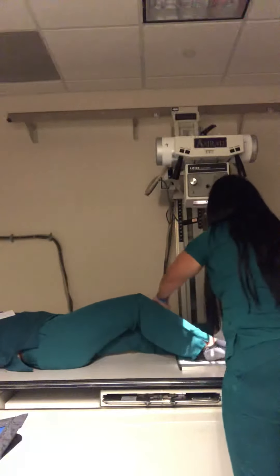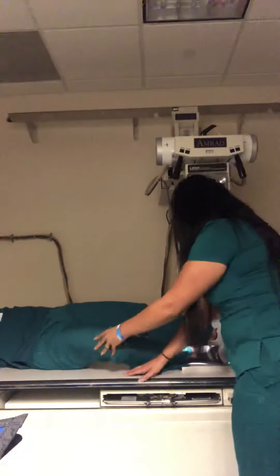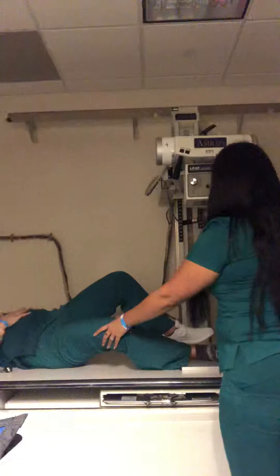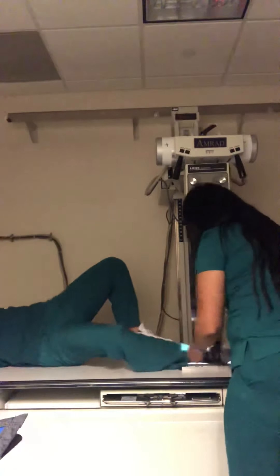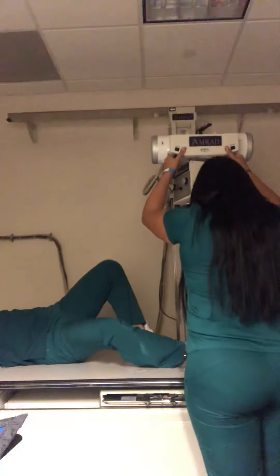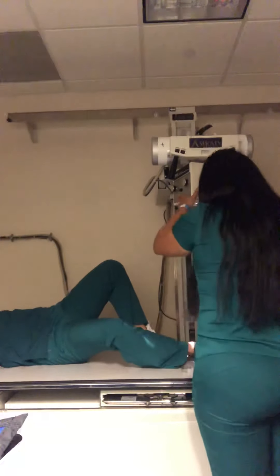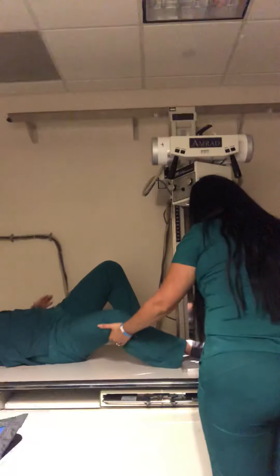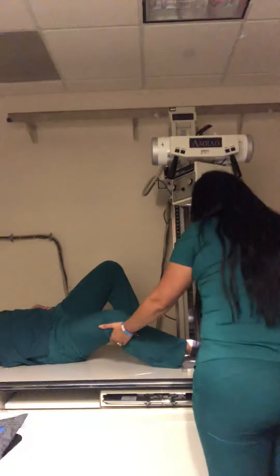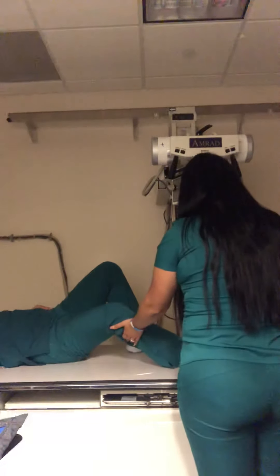Now I'm going to go lateral. So your knee has to be down more. You don't want to see the bottom of it.